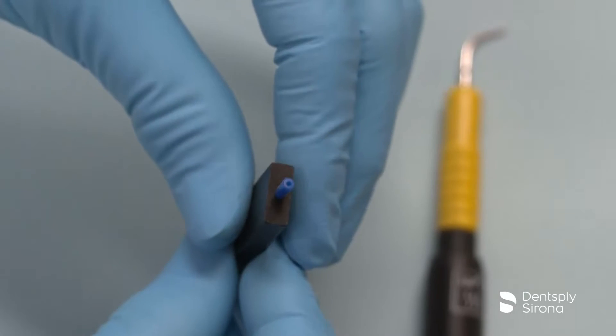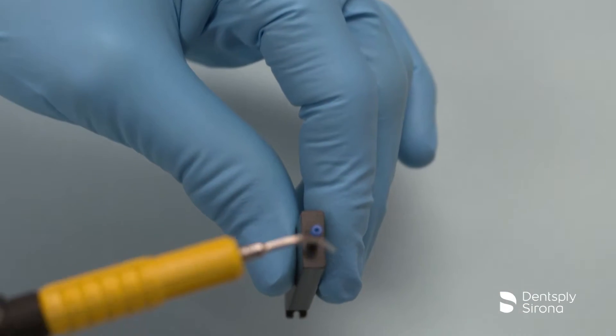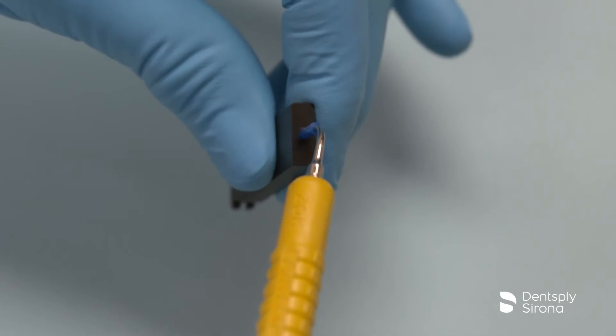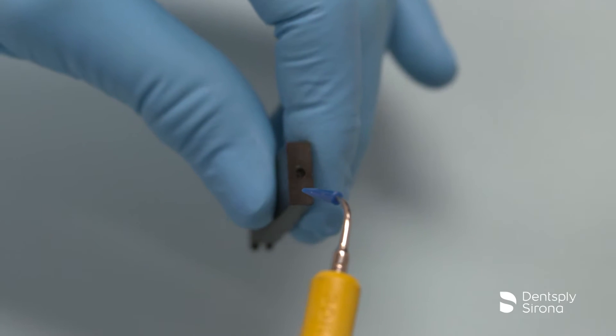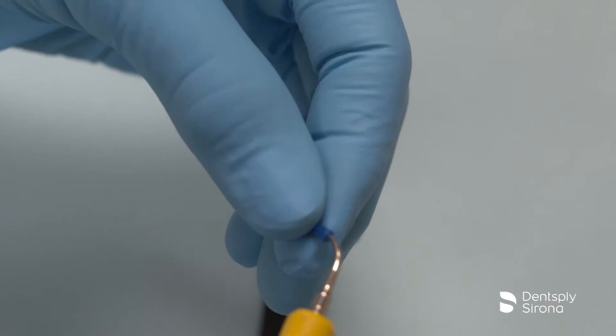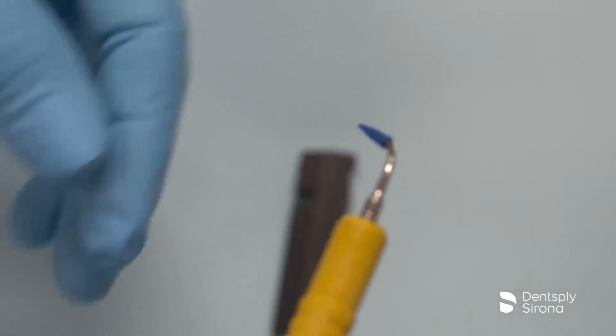Insert the metal tip of the insert into the opening of the Profi-Tip and twist one-quarter turn while applying firm pressure to securely seat the disposable Profi-Tip on the metal insert tip. Disengage the Profi-Tip from the wrench and gently pull on the Profi-Tip to verify that it is securely in place.